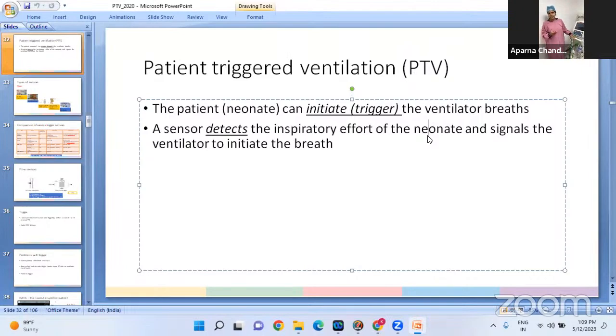In SLE 6000 and SLE 5000, you have a different mechanism of producing resistance, which is called reverse flow, or inverse flow. So here what happens is, instead of having a physical valve, the ventilator actually gives a reverse flow from the expiratory side towards the patient. This flow itself acts as a resistance producing mechanism for generating pressure at the patient interface.